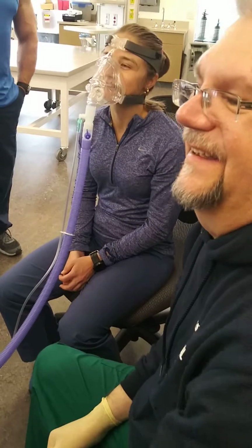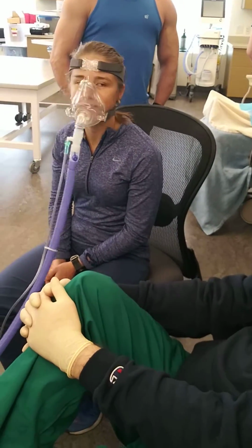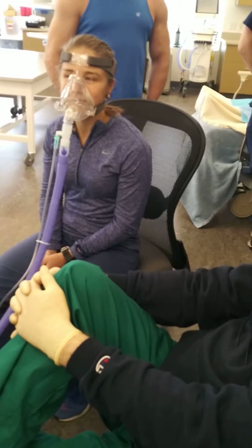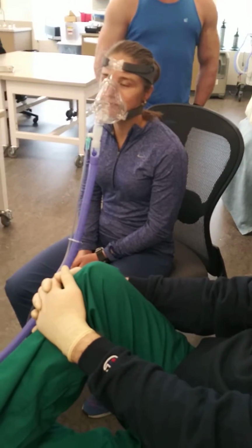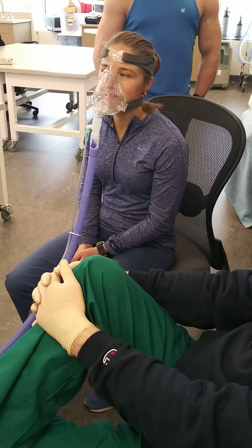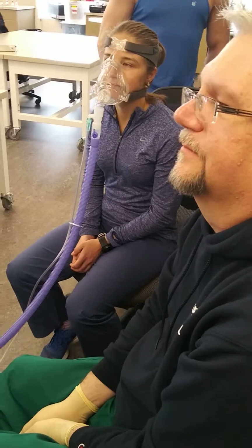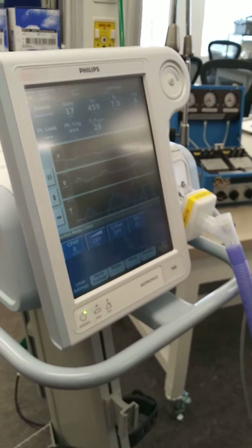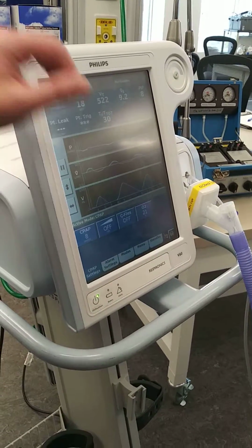That's great. Okay. Awesome. I want you to feel the difference between BiPAP and CPAP. So let's just do a CPAP straight of 8. Now, you'll notice that it's not blowing at you when you breathe in. It's just one pressure. So when it says spontaneous, that's her. Right? Mm-hmm.